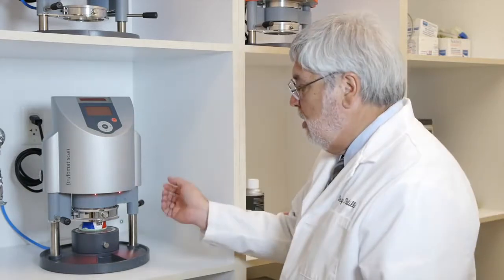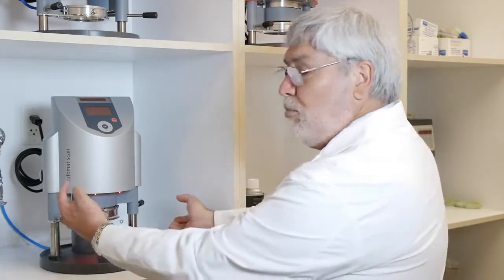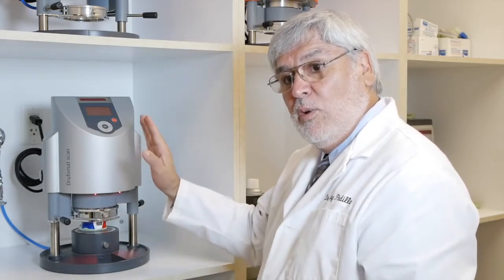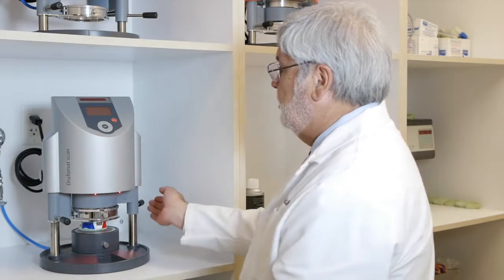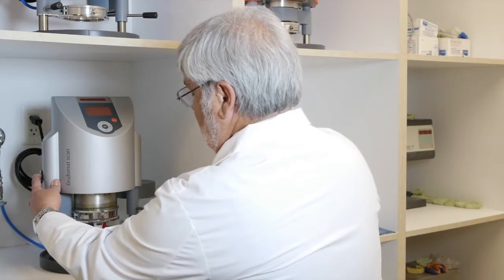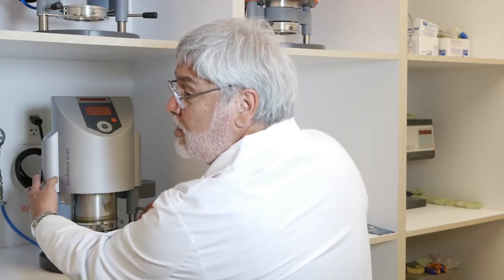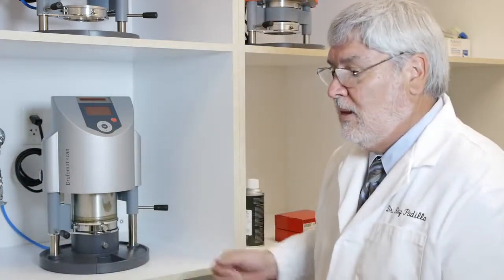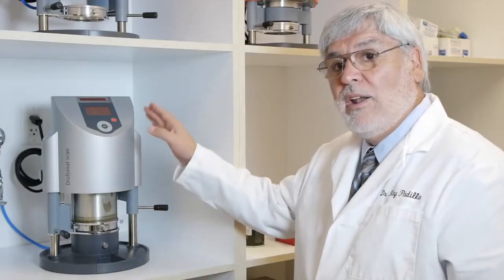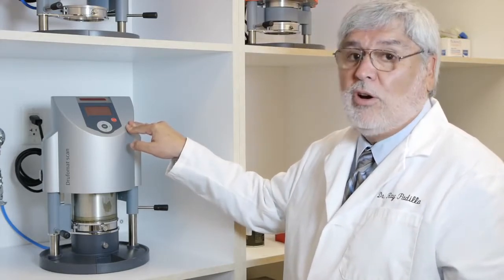Remember, when it hits 0, you're going to hear a beep. When you hear that beep, one continuous slow method, pull back all the way with your heating element, press the white button, and the piston will drop. You'll hear a beep first when the clock hits 0. Once you hear the second beep, it's properly pressurized. You can let go. Now that's going to cool under pressure for 8 minutes. You do not want to remove it before that time. It will be too soft and your mouthguard will distort.